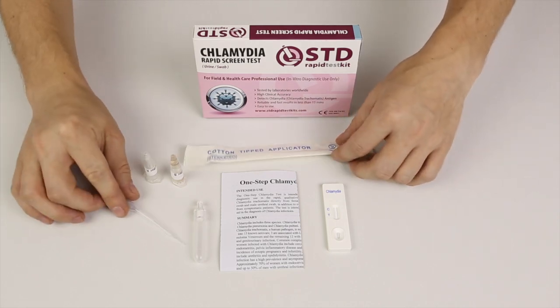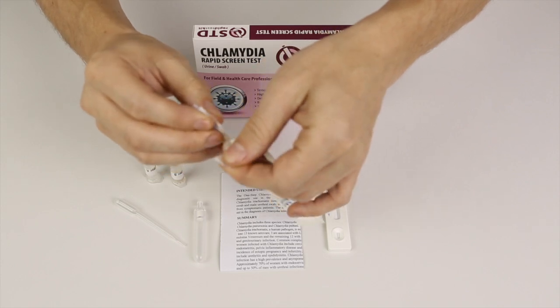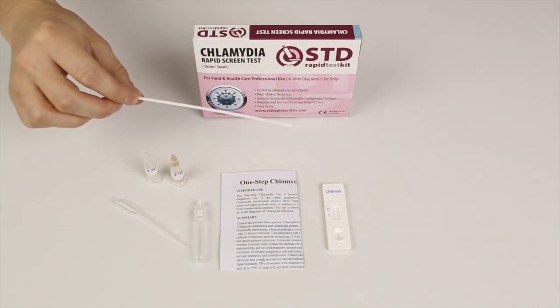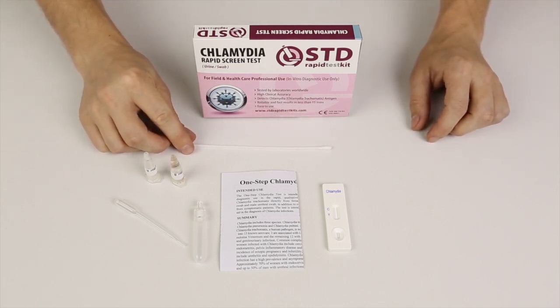I'll proceed by opening the package of the swab — I'll tear that open like this. That's the one we'll use for the test.